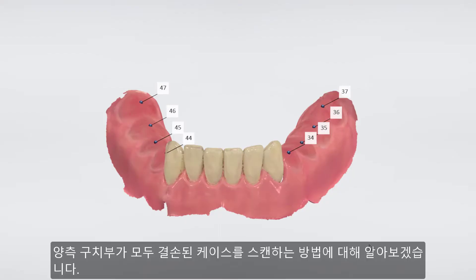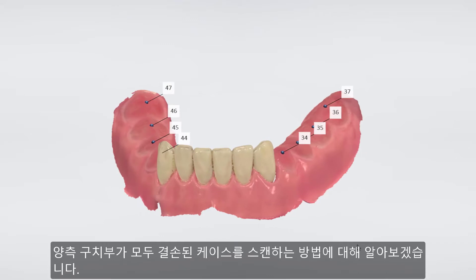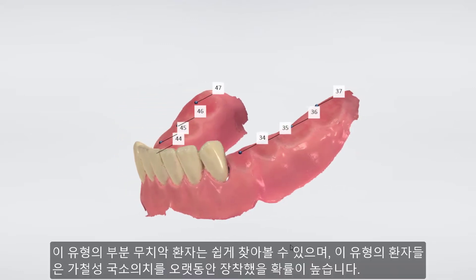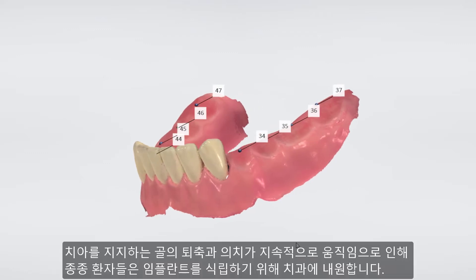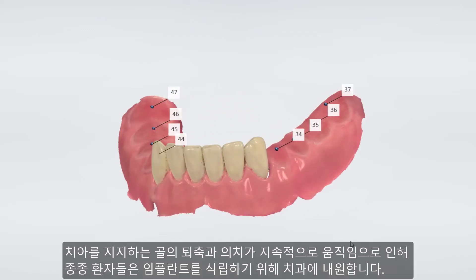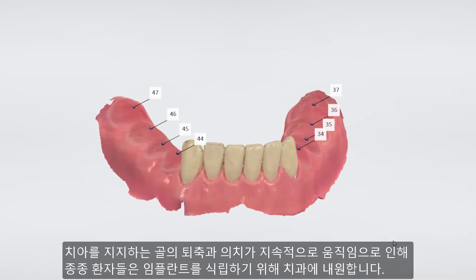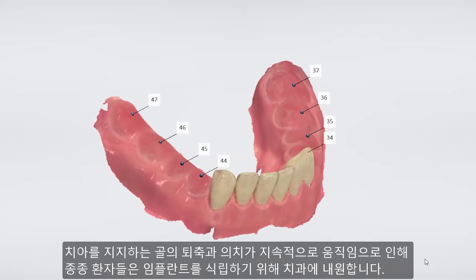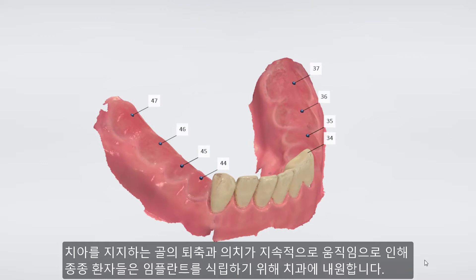Here we have a dual-sided free-end case with no teeth posterior to the canines. This type of partially edentulous patient is very common. They often have a long history with several RPDs, and due to the degeneration of the supporting bone and the constant movements of the denture, they often come to us seeking help and requesting implants.